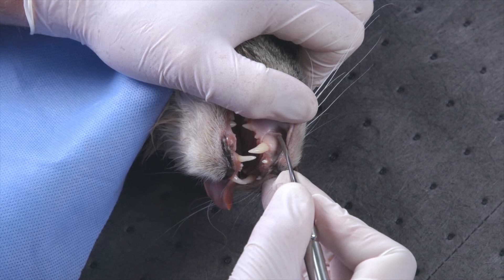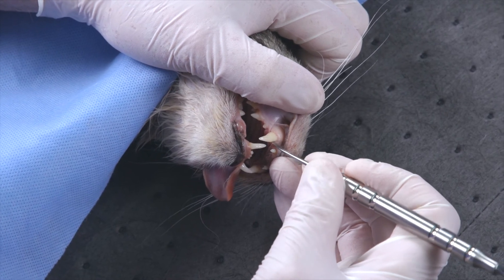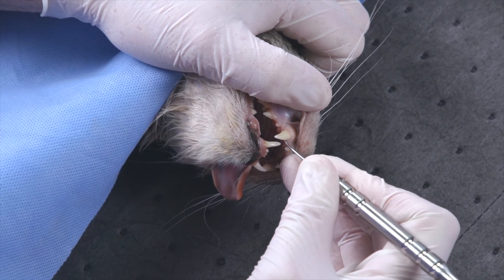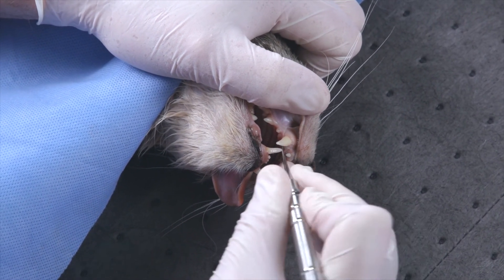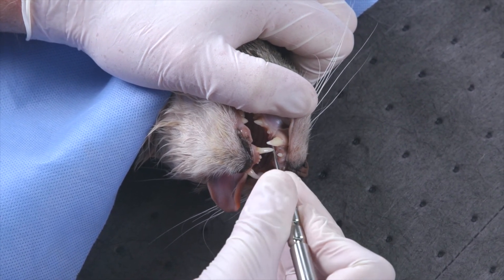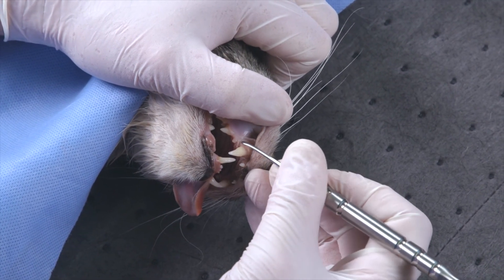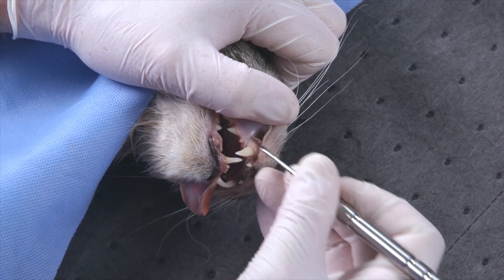I'll use the small side of the periosteal elevator to elevate the soft tissues on the other side of the incision — on the palatal side — prying this tissue away from the bone to help with suture retention when we're closing this defect.